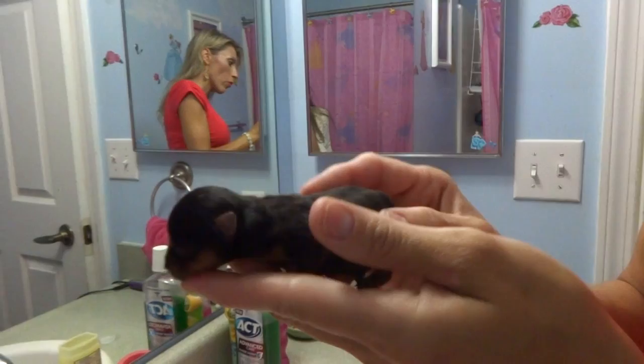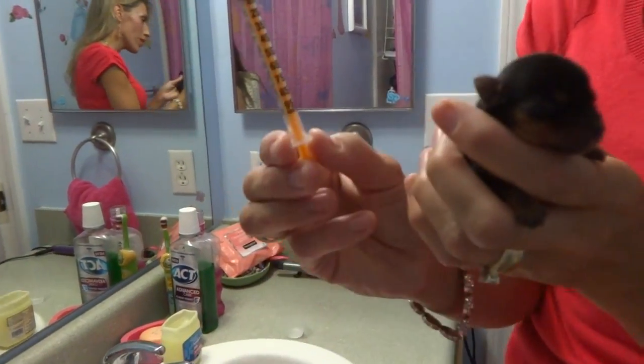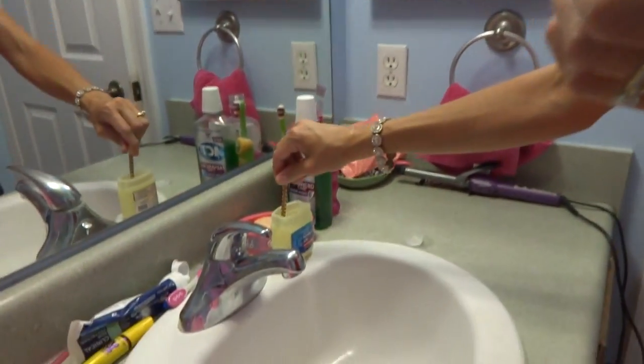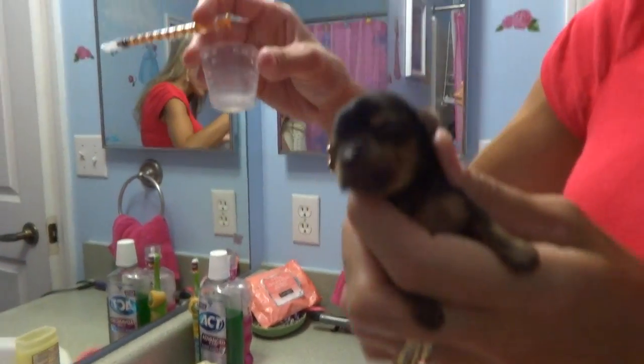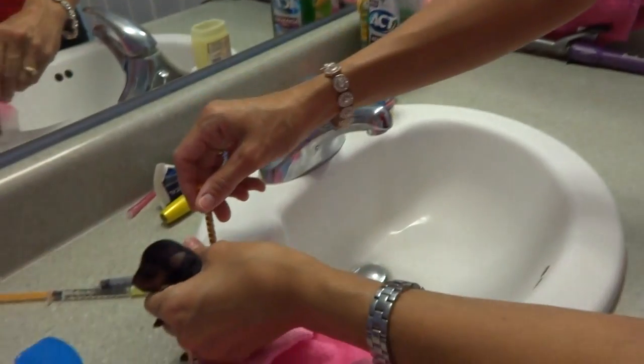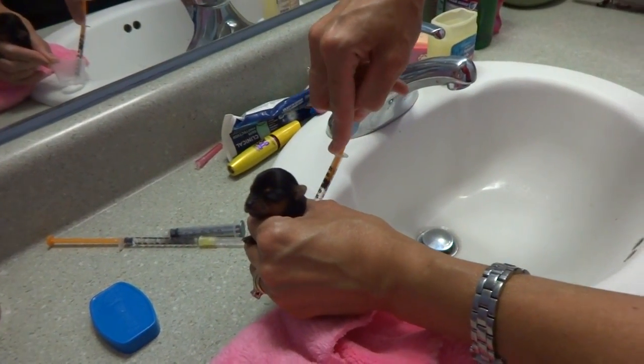So we're going to give her a warm water enema. I'm going to take a syringe, dip it in some Vaseline — just the tip — and I've got some warm lactated Ringer's here. I'm going to syringe it up.